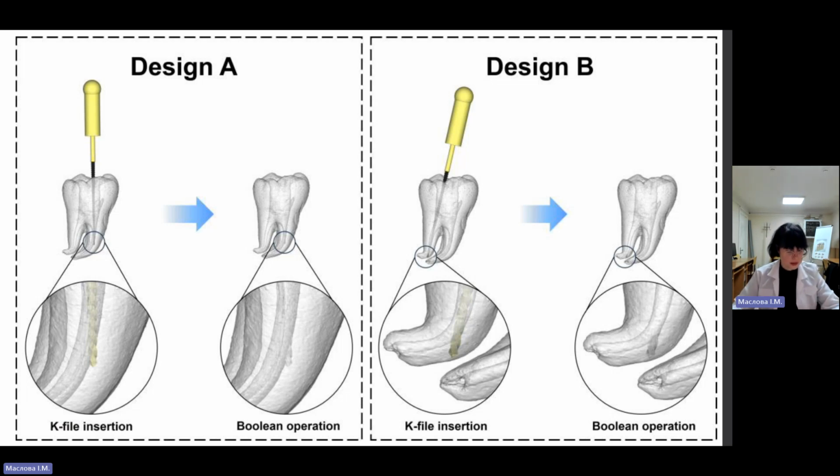Before the preparation of the access cavity begins, a good radiograph of the crown of the tooth, taken with a long cone paralleling technique, is studied. Especially the distance from the occlusal or incisal point of reference to the roof of the pulp chamber is noted. This distance may be marked on the bur to be used for the preparation of the crown to the pulp.